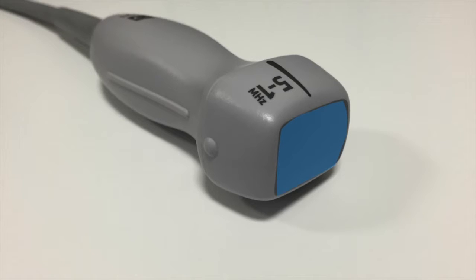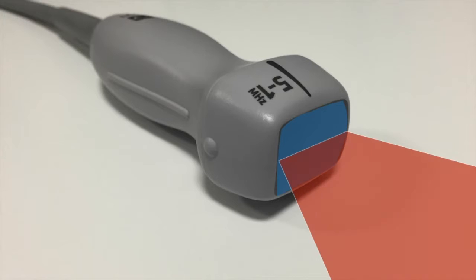So, the way that these crystals work is they generate a nice beam. So it's very flat and it's very thin, and you see that it spreads out. So it's pretty much in a sort of two-dimensional plane. And some people liken it to a wallpaper scraper.